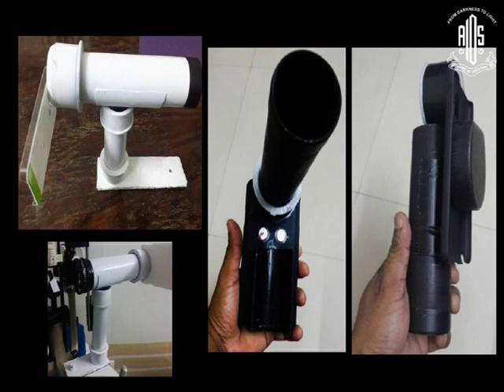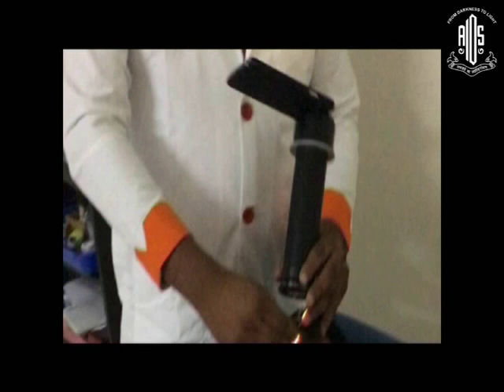And with a couple of magnets and a holder, you can take apart the optical tube and fix it. You can even put a 20D on the case, and the whole thing fits into your pocket. So it becomes a very ultra portable thing, which you assemble when you want to start doing the photography. Just to show you how I do it.